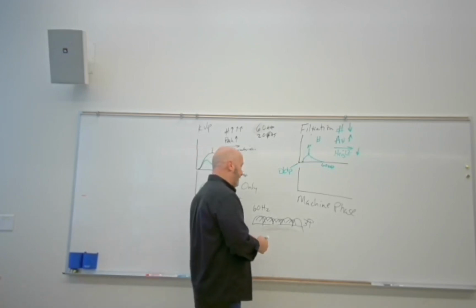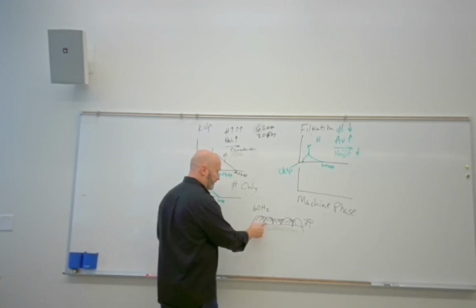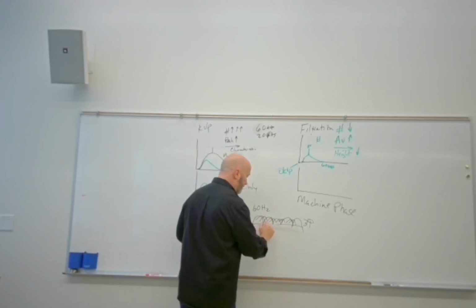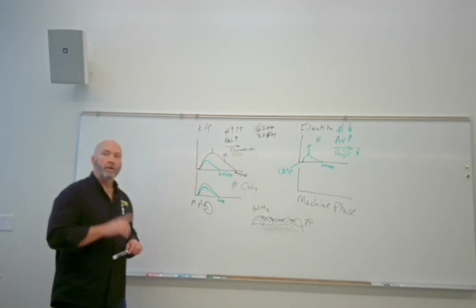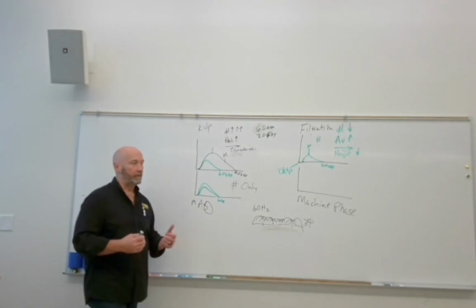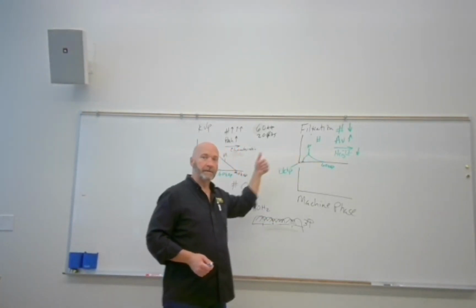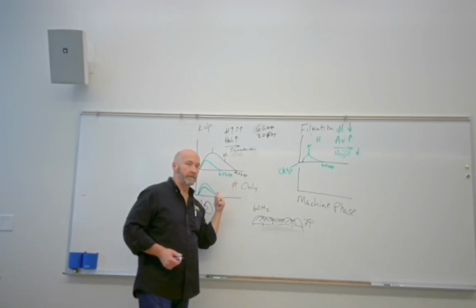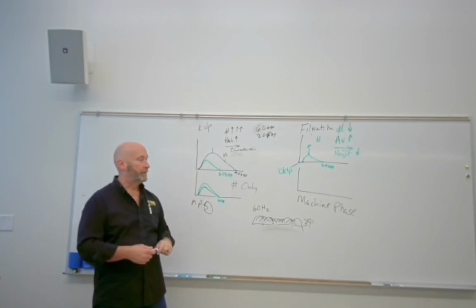So what that means is that if we've taken away all these minimum test scores, then our average is going to go up. What controls minimum energy? The only thing that controls maximum energy is kVp, right? So those two are off the table.